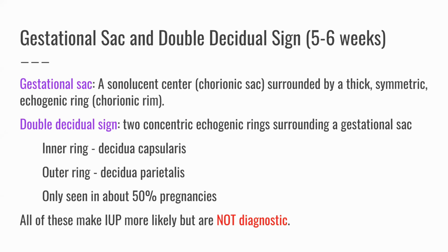So this has a decent amount of text on this slide, and I apologize for that, but there are some very important definitions here. The first thing that you will see in the developing pregnancy, and we'll go progressively through the timeline, and all of the numbers, by the way, in the top right hand of the screen are going to be for weeks of the transabdominal ultrasound. For transvaginal ultrasound, you'll see all of these findings about a week earlier, give or take.